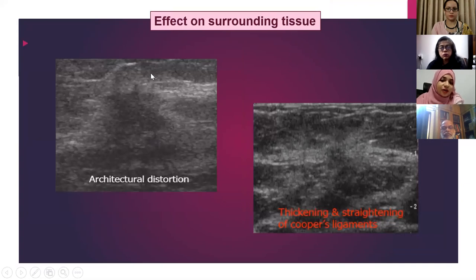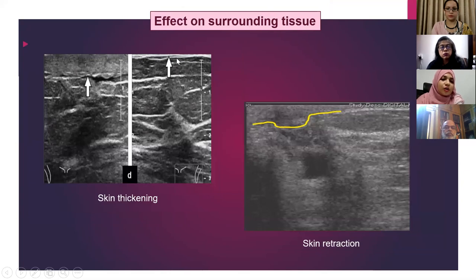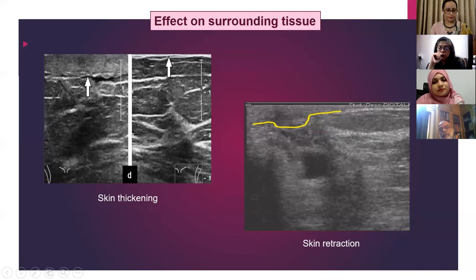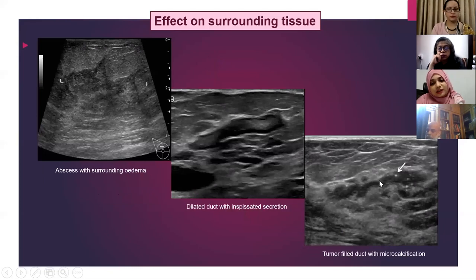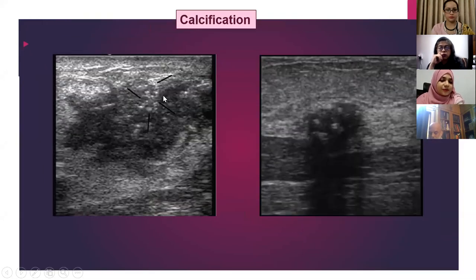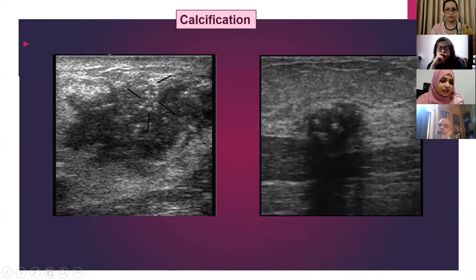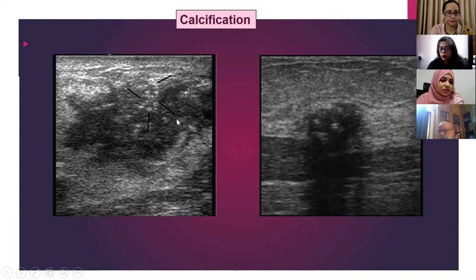You can see the skin is thickened in comparison to the normal side, and in another image the nipple is retracted. There can also be edema of the surrounding breast parenchyma or ductal dilatations. If we get a dilated duct, we need to look at its content — whether there is inspissated secretion within, or whether the duct is packed with tumor cells. Regarding calcifications, there are two types: microcalcifications, which raise suspicion for malignancy, and macrocalcifications, which are usually benign and can be found in fibroadenomas. For evaluation of microcalcifications, mammography is better than ultrasound.